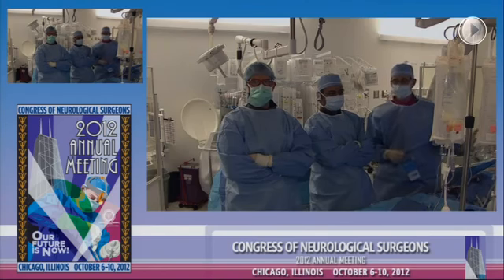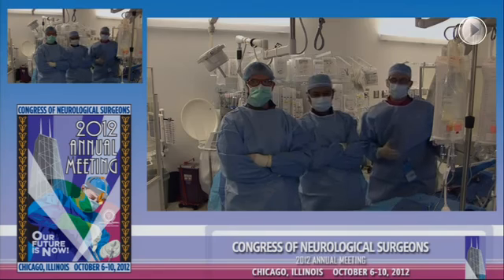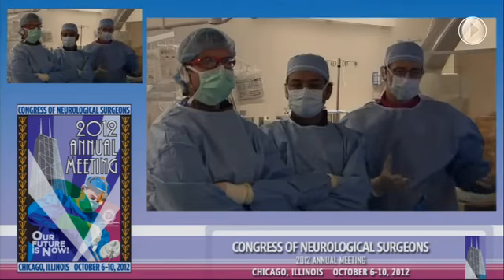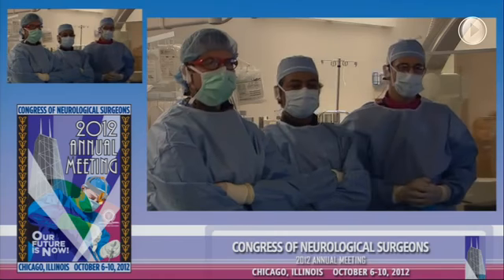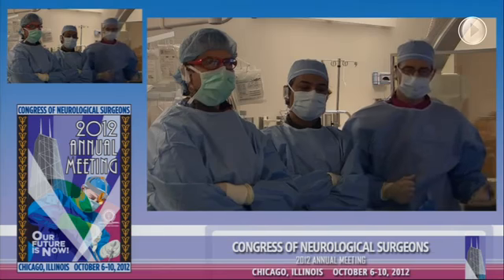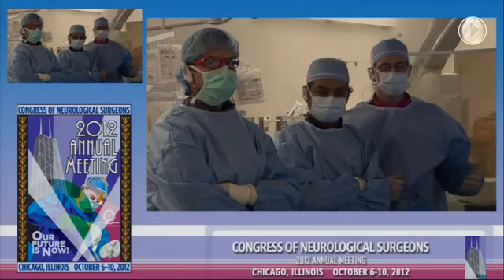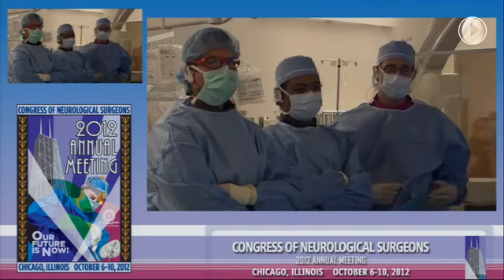So it's very reasonable to clip this patient, but she came in as a Hunt-Hess 4, so we elected to coil her. We don't really want to take a Hunt-Hess 4 or 5 to the OR. We coiled her, we patch coiled her, and she did very well, and over the course of about a week, she woke up and made a very reasonable recovery. So now that merits a definitive treatment. We elected to do flow diversion at this point. Had she been a healthy grade, Hunt-Hess 1 or 2, very reasonable to consider clip ligation for this aneurysm.